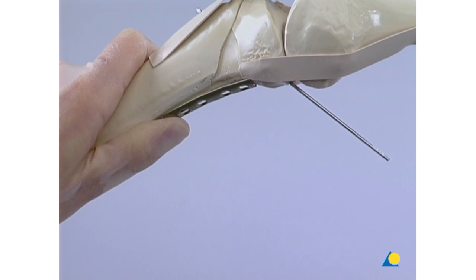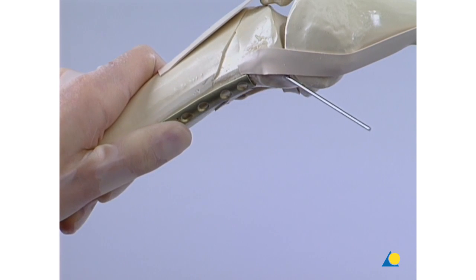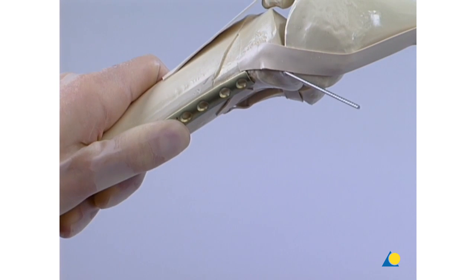A five-hole, one-third tubular plate is positioned on the posteromedial crest of the tibia. Only minimal plate contouring is required, if at all.